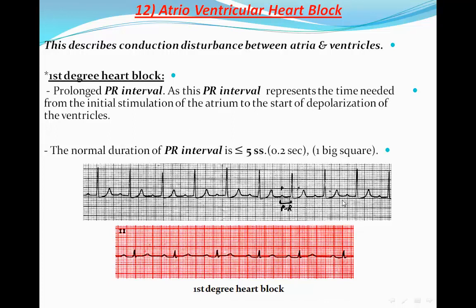In this example, there is prolongation of the PR interval — it is more than one big square from the beginning of the P wave to the beginning of the QRS complex. In this other example, we have a much more prolonged PR interval — from the beginning of the P wave to the beginning of the QRS complex, it is more than one big square. This is first degree heart block.